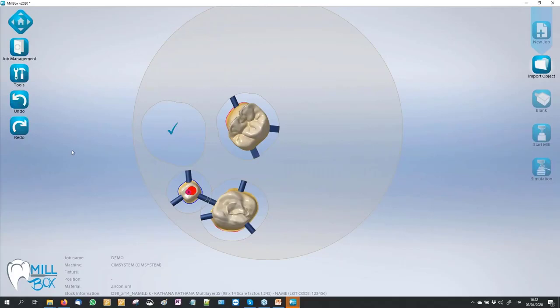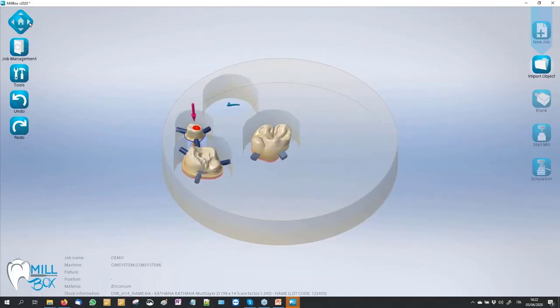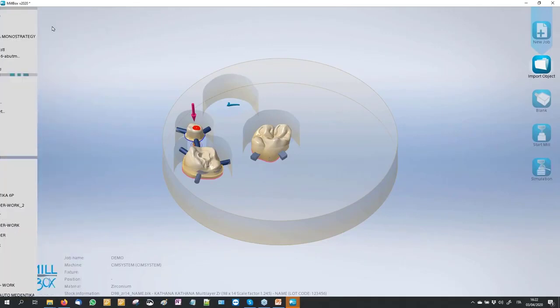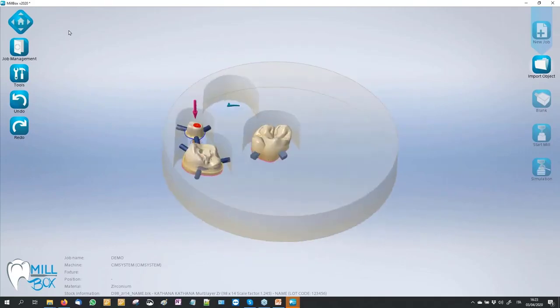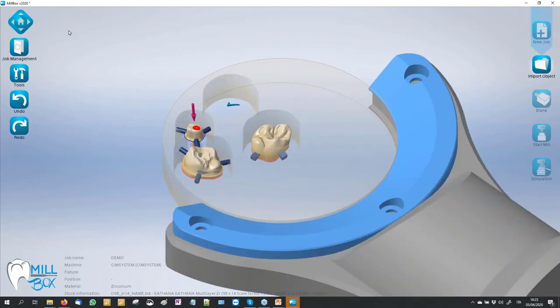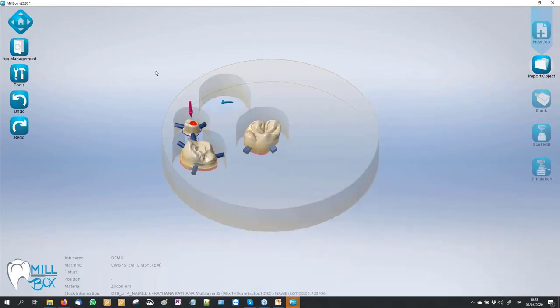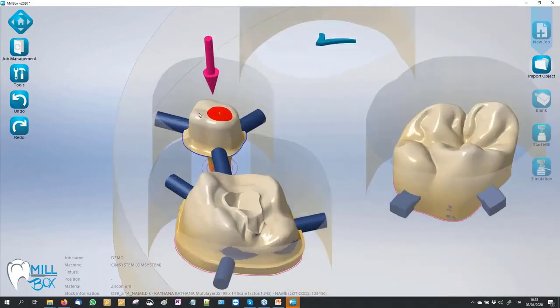We go on to show some other tools in the second bar. Here are only some pre-set views that we can also access with F5, F6, F7, F8, F9 to rotate our stock. With Control+A we can show and hide the holder, and with other hotkeys we can show and hide elements very fast — like the red cap with Control+R.